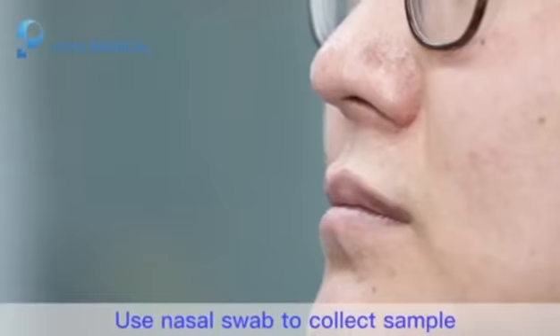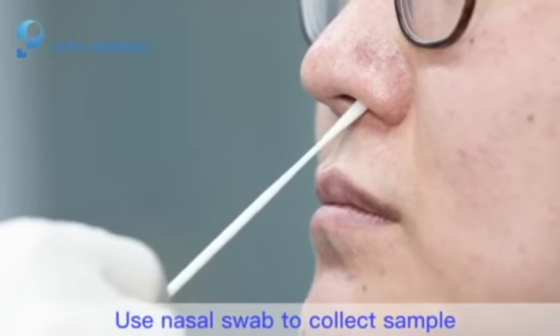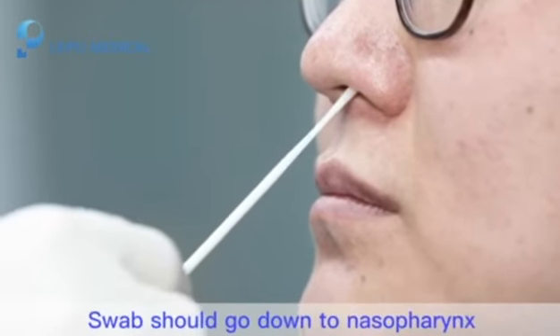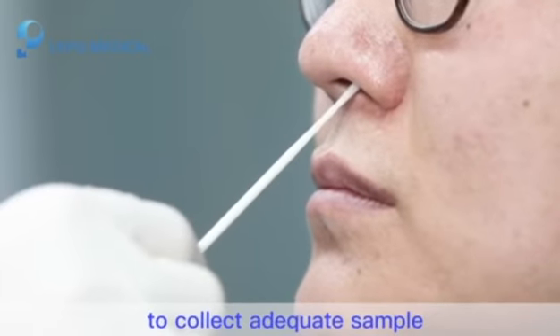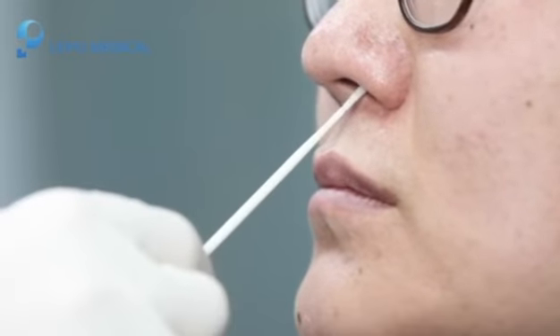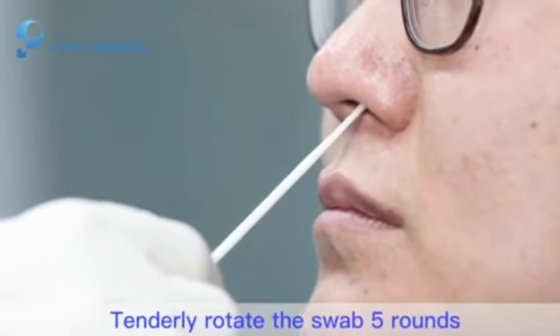Step 3: Use nasal swab to collect sample. The swab should go down to the nasopharynx to collect an adequate sample. Tenderly rotate the swab 5 rounds.